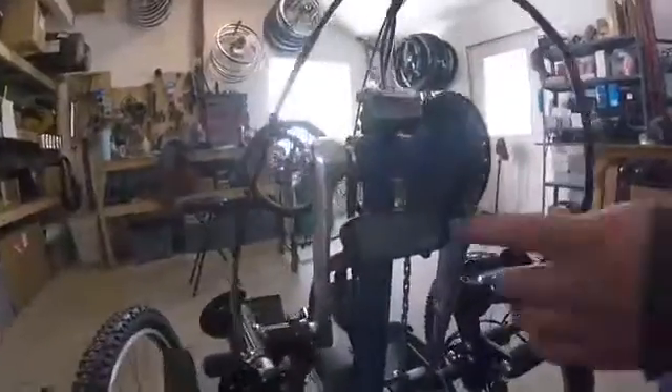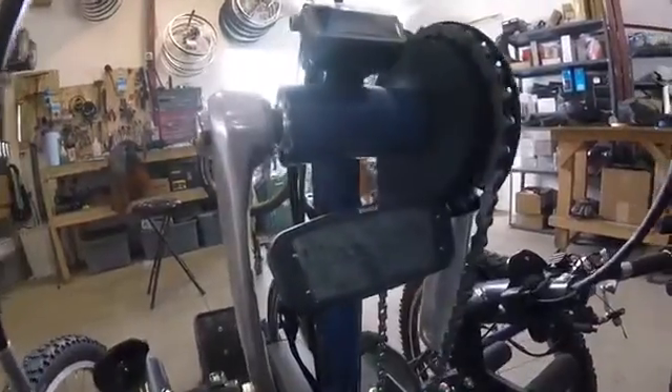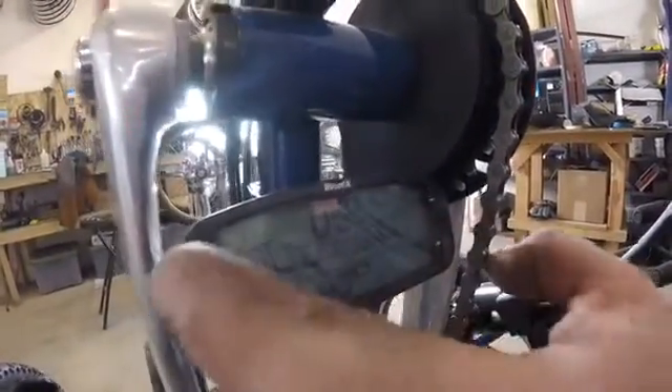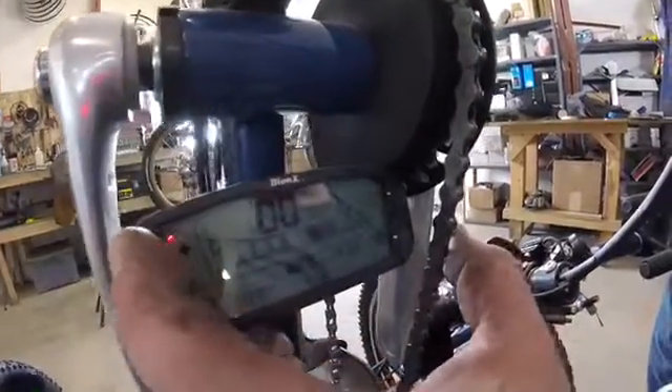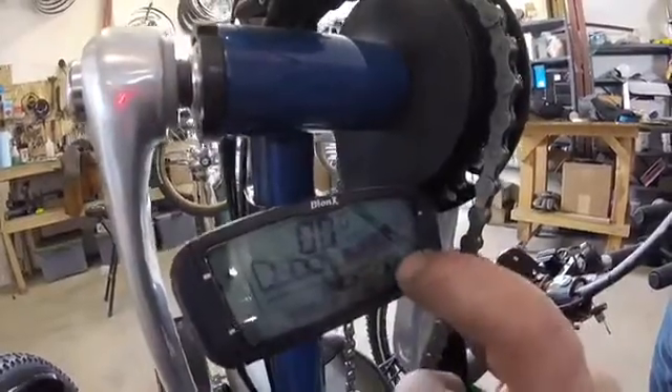To turn the console on, you hit the power button right here. Give it a couple seconds and it'll beep three or four times. In order to turn up the assist level, you hit the plus sign here. It's got four levels of assist — you can see the four levels here and it says 'assist' right here.